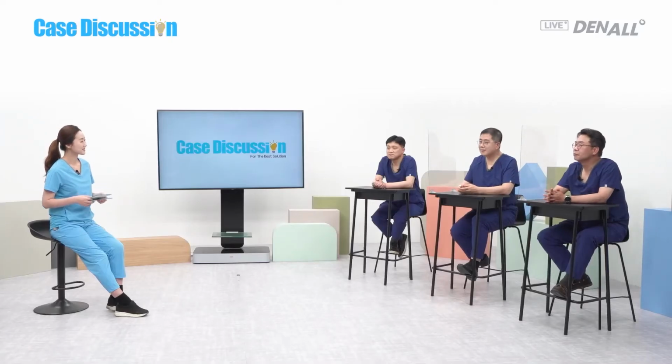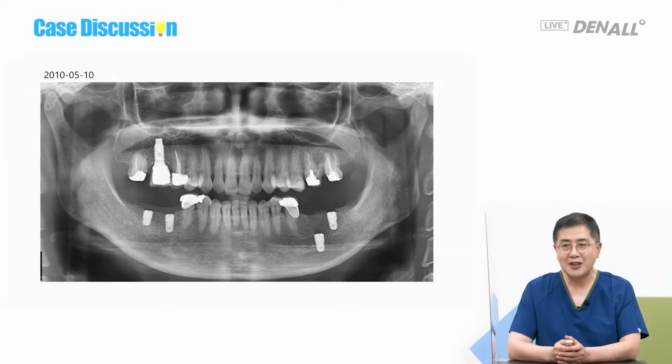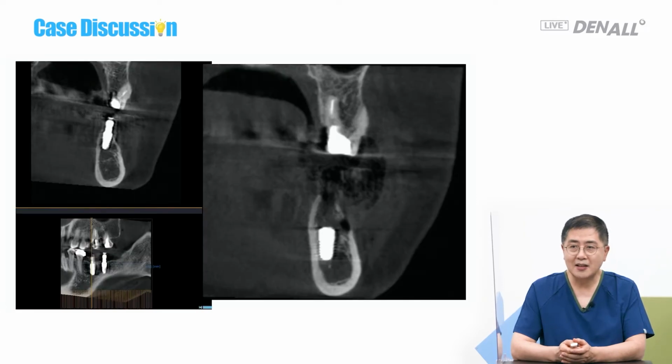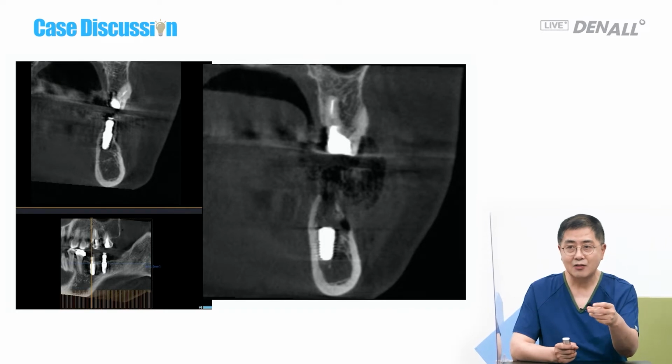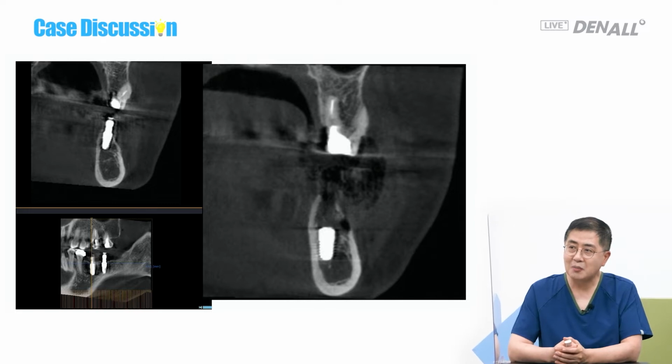Dr. Kim Ki-Seong has prepared a similar case. Would you explain that, please? I was in trouble once at number 36 while I was placing an implant. I thought the bone quality was not really bad. On CT, actually, initial stability was obtained. I disconnected the mount, and while connecting the cover screw carelessly, it happened. The implant fell into the, so to speak, mandibular sinus. It fell while the connected cover screw was being tightened, so there was no way to retrieve it.